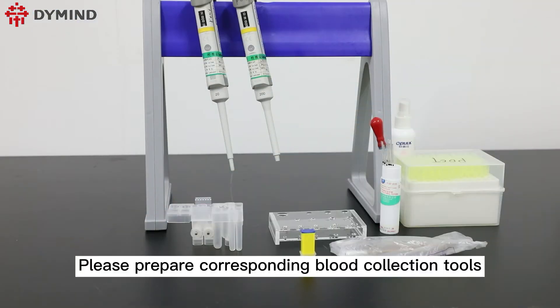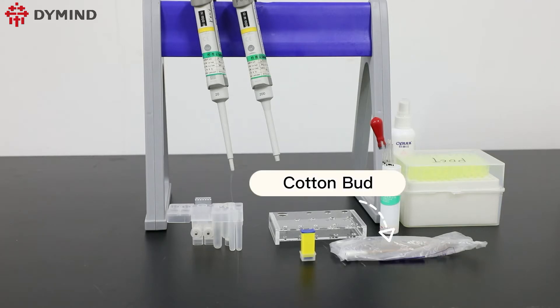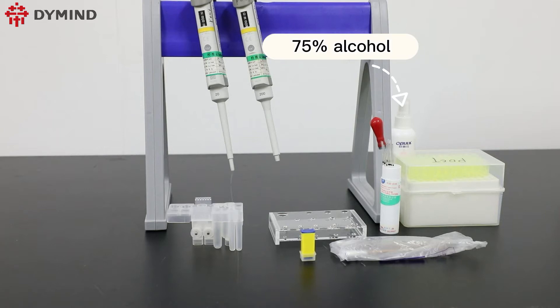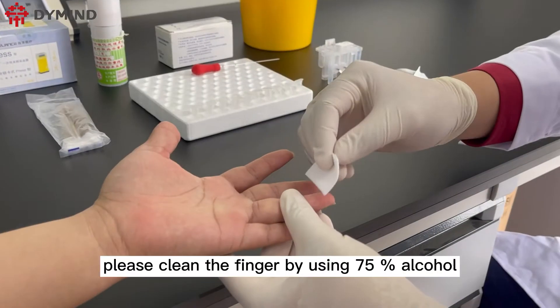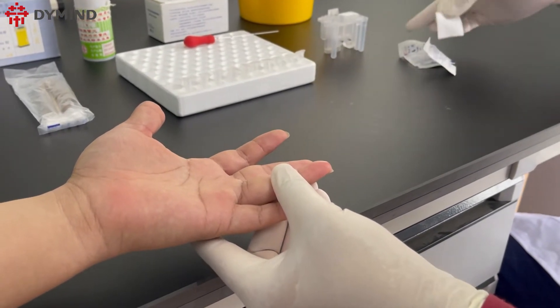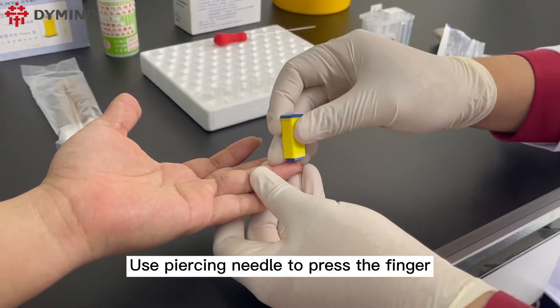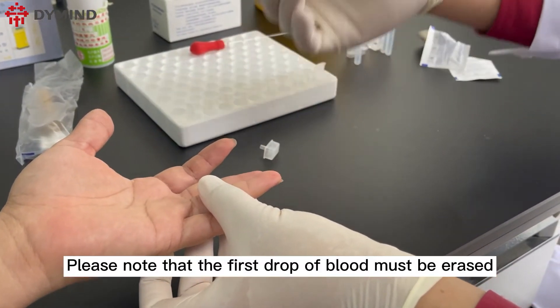Please prepare the corresponding blood collection tools: piercing needle, cotton bud, 75 percent alcohol, and capillary pipette. Please clean the finger using 75 percent alcohol, then use the piercing needle to press the finger.